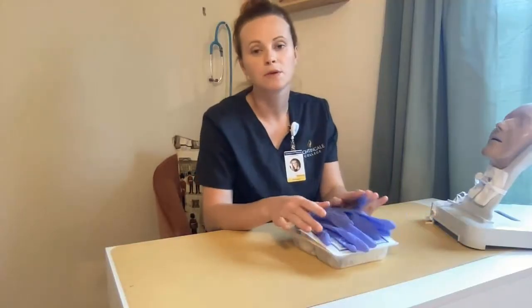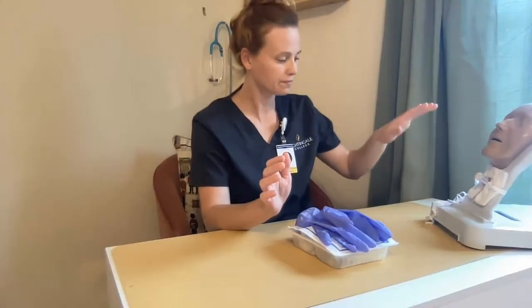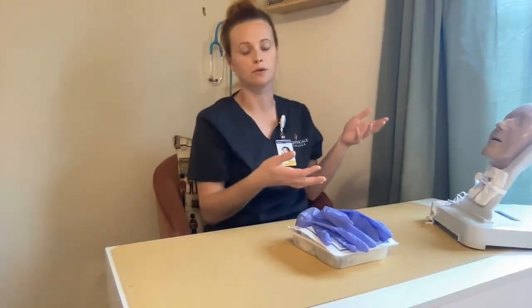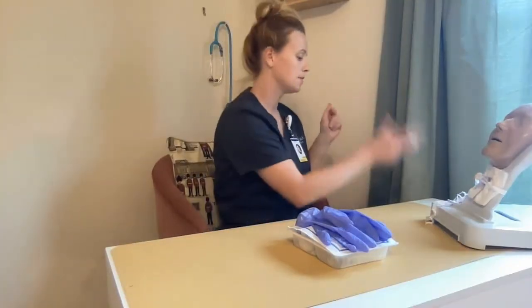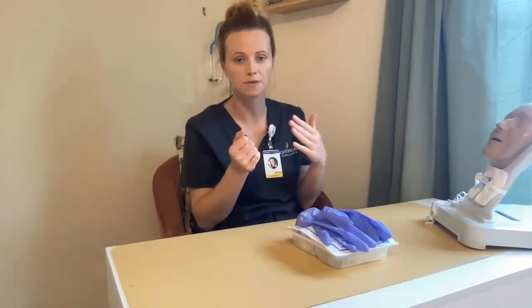Preferably in a real-world setting, we would have three people doing this — one performing the procedure and one stabilizing the tracheostomy. I would perform my initial introductions to my patient, then come over and perform hand hygiene. Then I'm going to set my patient up in a semi or high-Fowler's position.